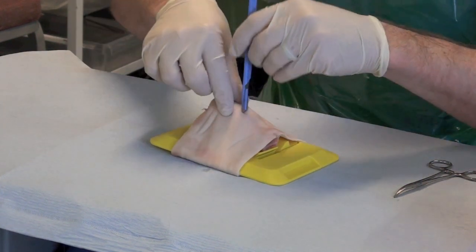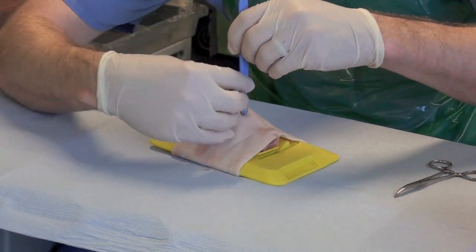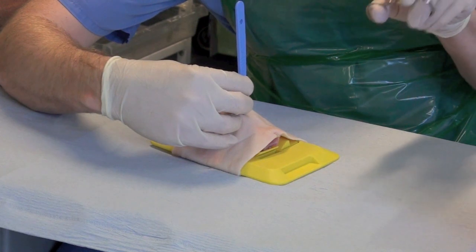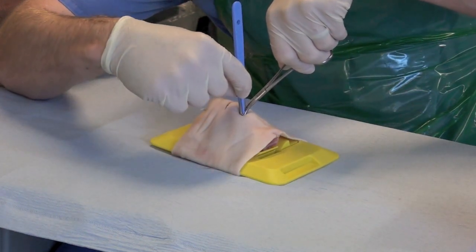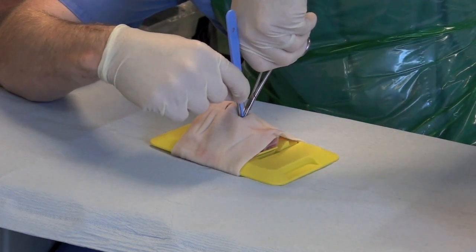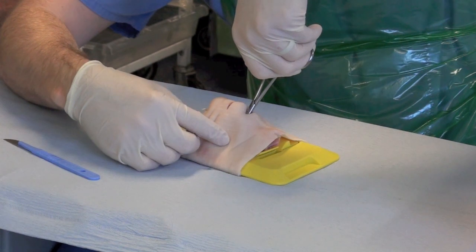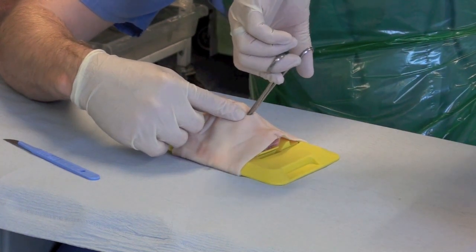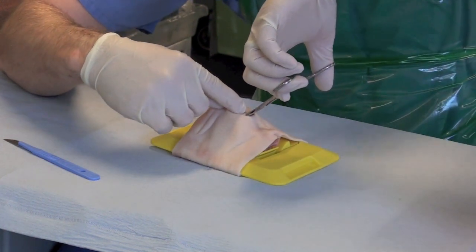Okay, just going through the membrane. The scalpel blade is now through the cricothyroid membrane. I'm going to bring my non-dominant hand around the back of the patient's head and hold the blade with that hand, and using my dominant hand, using the curved nose forceps, just work the way down and hold on the blade. Holding the blade with the forceps, slide them down the blade into the jug here. At this point I'm going to take the blade out — keeping my eyes fixed on the specimen, on the hole — and rotate the forceps down, then open the forceps to create the hole into the cricothyroid membrane.